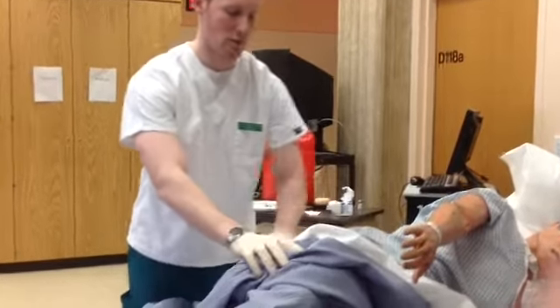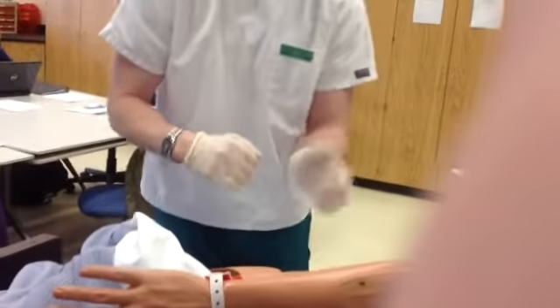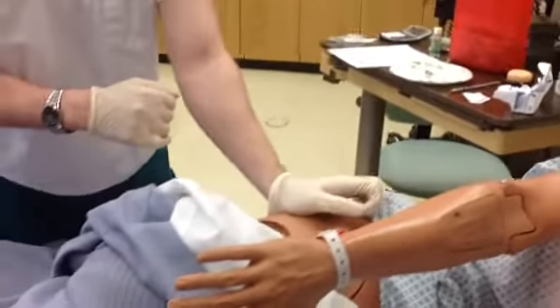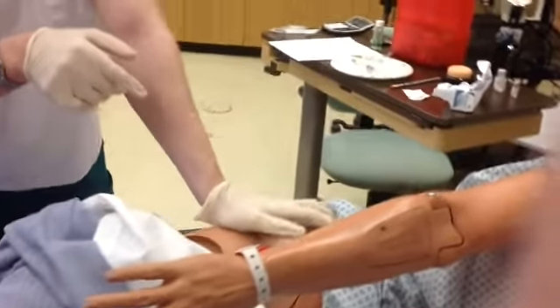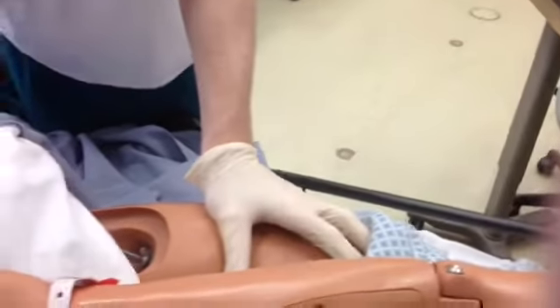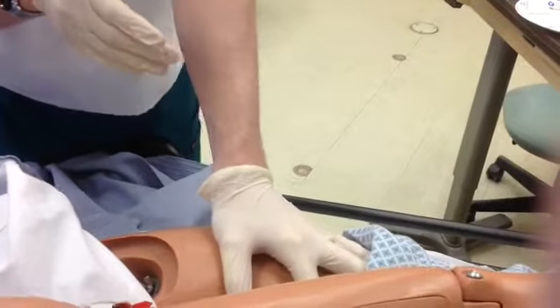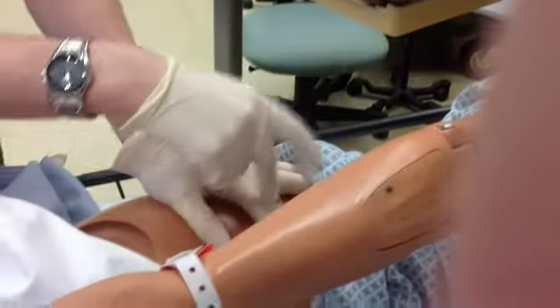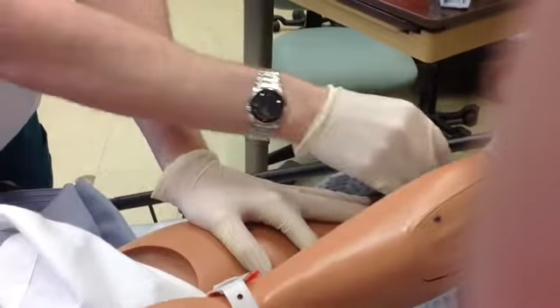So like I said, this is going to be in his ventral gluteal site. So to obtain that, I need to be able to find out where his greater trochanter is. So I will end up putting my palm located on his greater trochanter. I will put my fingers up towards his iliac crest. And then I will also fan out my fingers towards his pubic area. And the spot that lands between my index and middle and ring finger is going to be the site that I will give the injection.